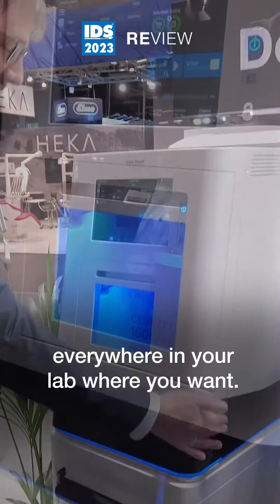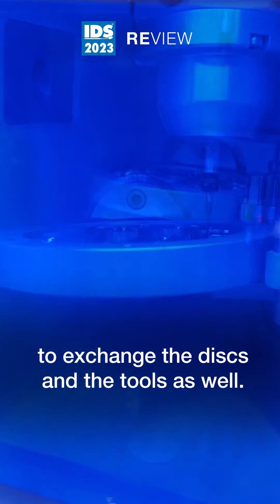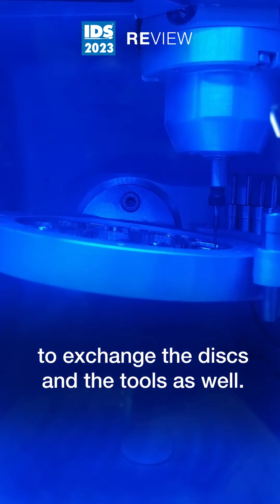This compact machine can stand everywhere in your lab where you want. The wide door gives you easy access to exchange the discs and the tools as well.